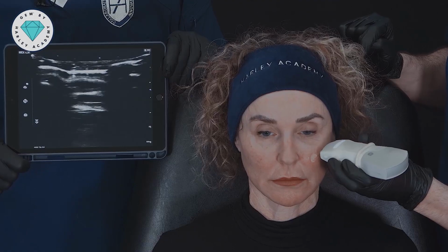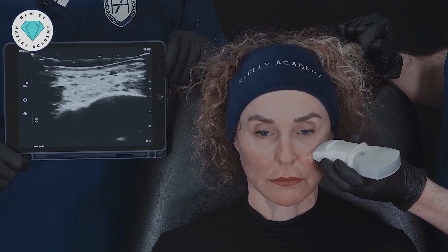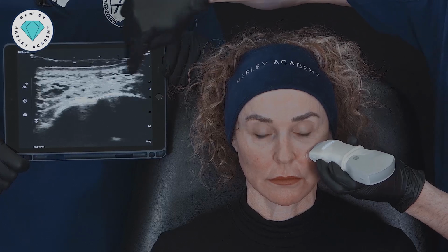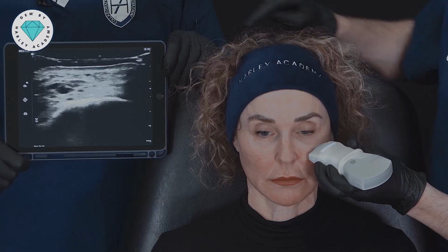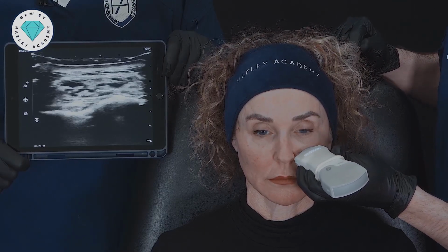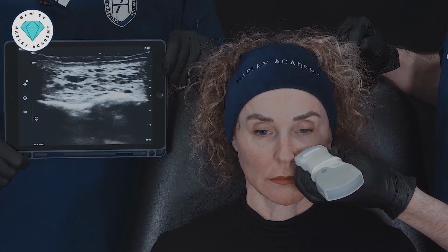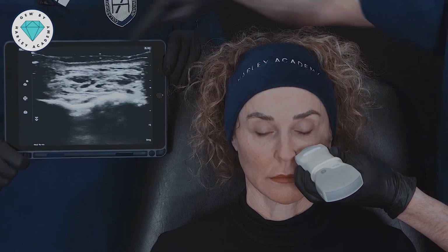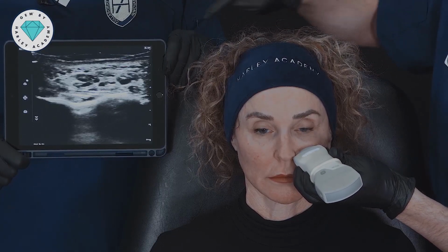This is our lateral zygoma here. As we come medially, we can see it dropping off the medial zygoma towards the apex of the cheek, towards our deep fat compartments, heading right down towards the piriform fossa on the left-hand aspect of this screen.